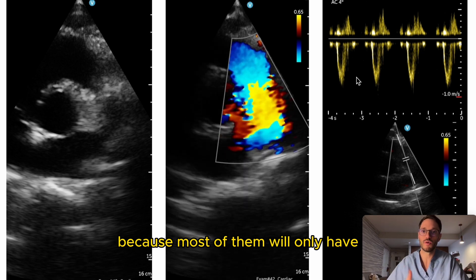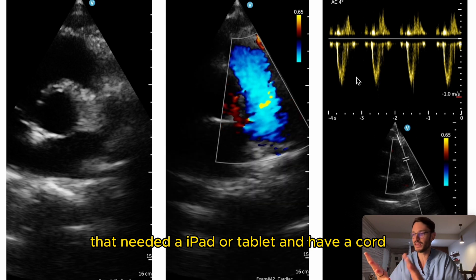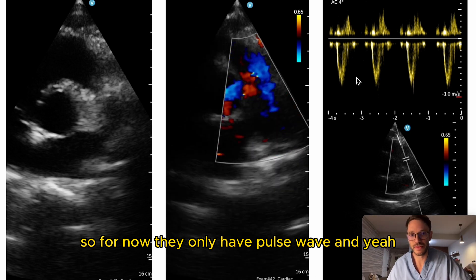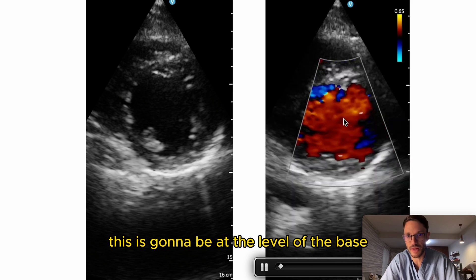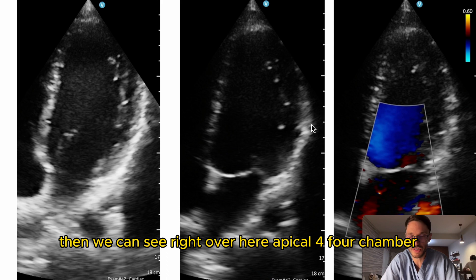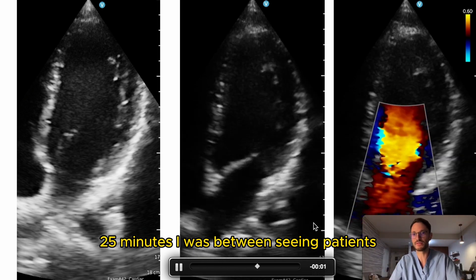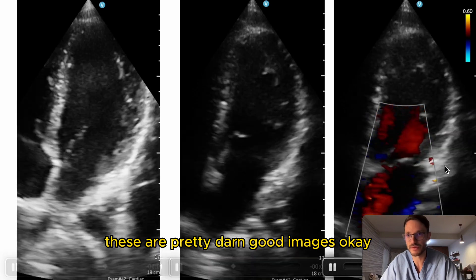Pulse wave Doppler is a limitation with most handheld devices — if you want continuous wave Doppler, you'd need a larger device requiring an iPad or tablet with a cord, which defeats the handheld purpose. For now, pulse wave is the best you can get. Here's a short axis view at mid-level and at the base — the mitral valve and papillary muscles are visible. Then we see apical four-chamber, a very good image. These were taken in 20–25 minutes between seeing patients, so not perfect, but pretty darn good.